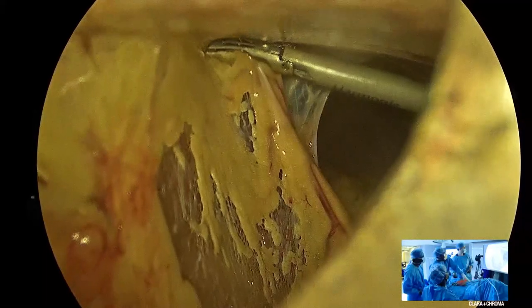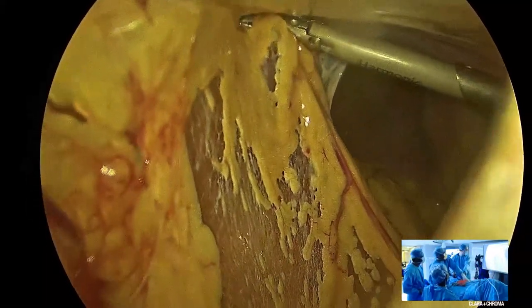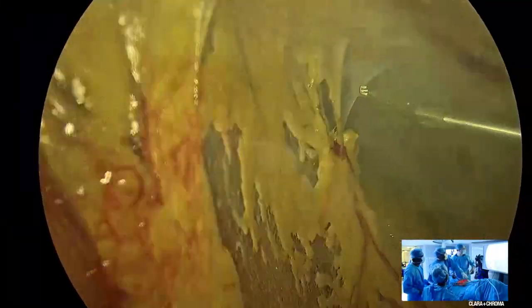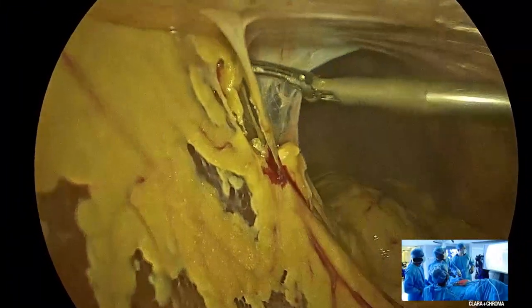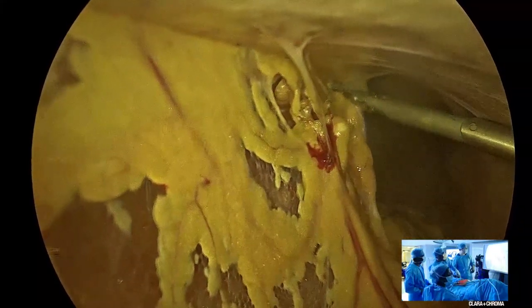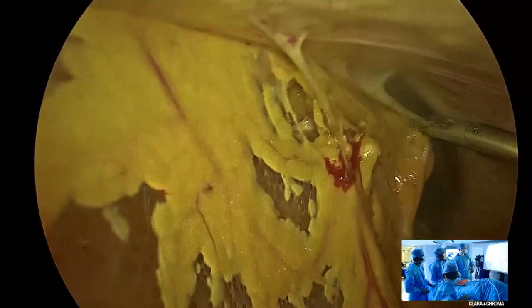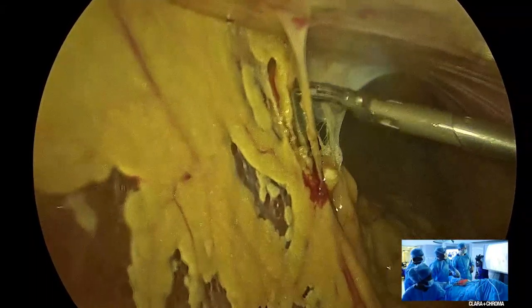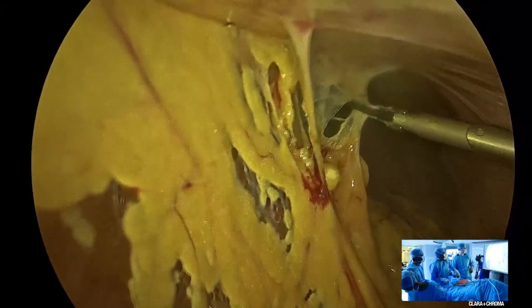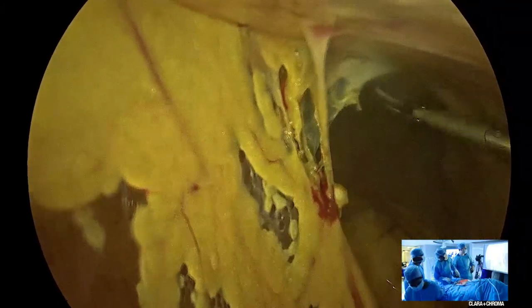Ideally, you would want to do an adhesiolysis with a bit of counter traction, but because I have put my ports bearing in mind that it's going to be a right hemicolectomy later on, I have not positioned them in such a way that it's going to be easy for adhesiolysis. I would rather do an adhesiolysis with a bit of difficult ergonomics, and then have better ergonomics for the main operation than the other way around. So that's why you see me doing adhesiolysis here without giving counter traction.